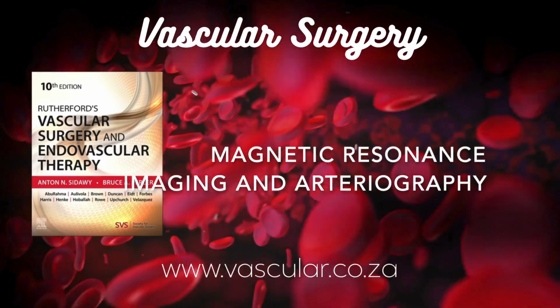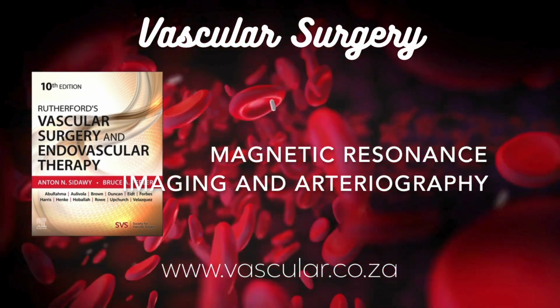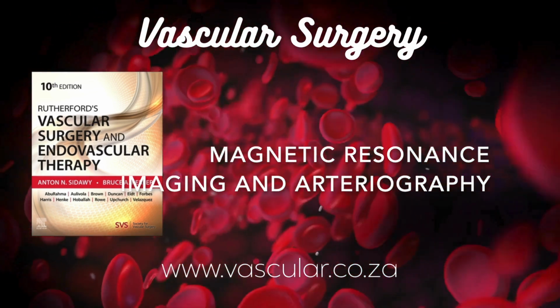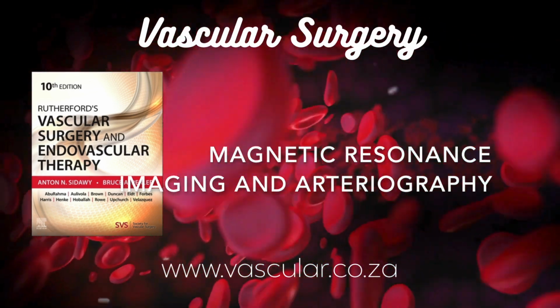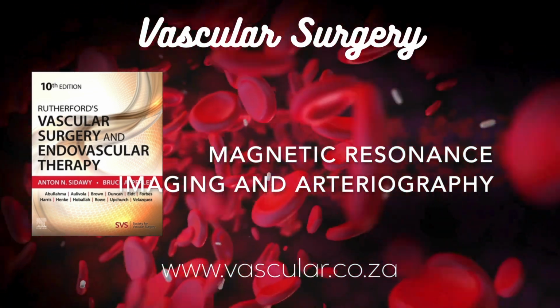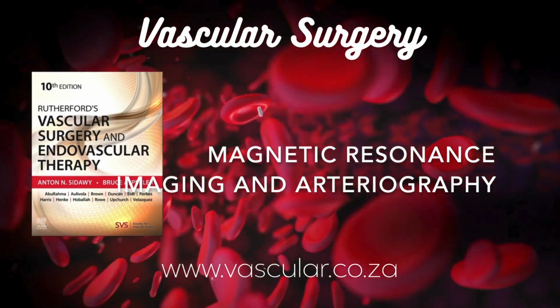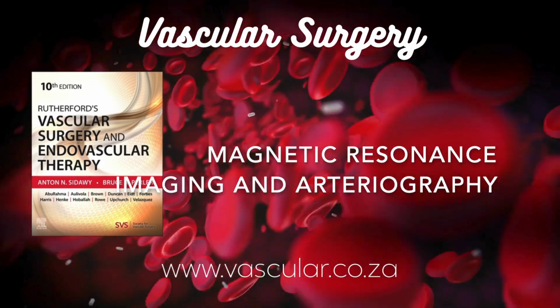The versatility is just amazing. Arteries, veins, all over the body. The outline mentioned other applications too. Any quick examples? Sure. It's used for thoracic outlet syndrome, often with special arm positions, essential in kidney transplant evaluation both before and after surgery to check the vessel connections. Okay. Good for large vessel vasculitis like Takayasu arteritis, can detect pulmonary arteriovenous malformations quite well. And a newer use is mapping out tiny perforator arteries in the abdominal wall for certain types of breast reconstruction surgery called DIEP flaps. Incredible range.